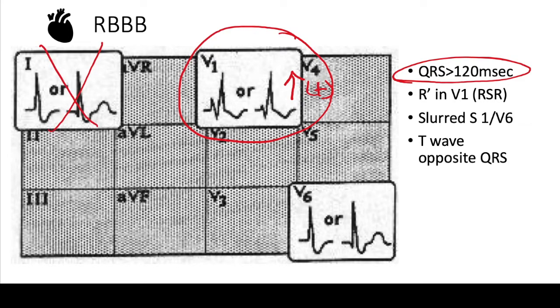Again, do not look at lead one or V6. Do not try to find these other criteria because that will just confuse you. Here, with right bundle branch block, the majority is positive, so you know it's a right bundle.